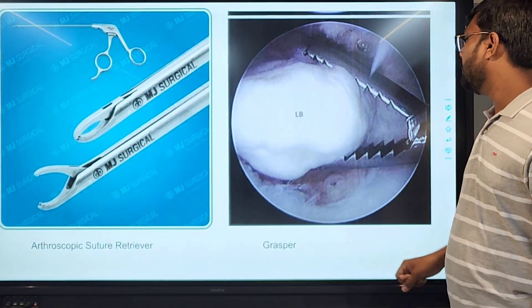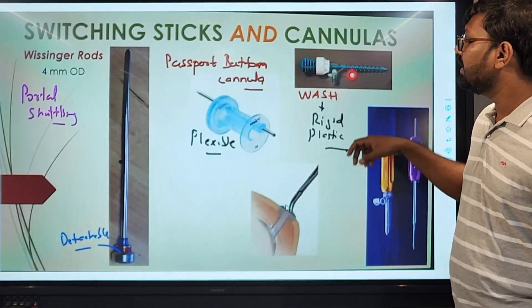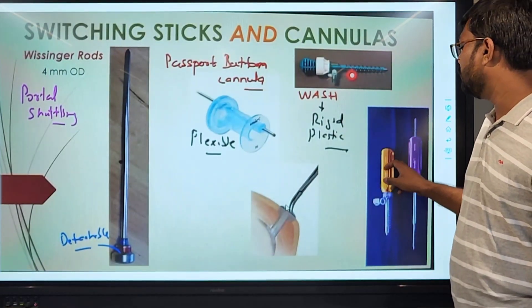This is the arthroscopic suture retriever, and this is the grasper. These are switching cannulas, mostly used in shoulder arthroscopy.